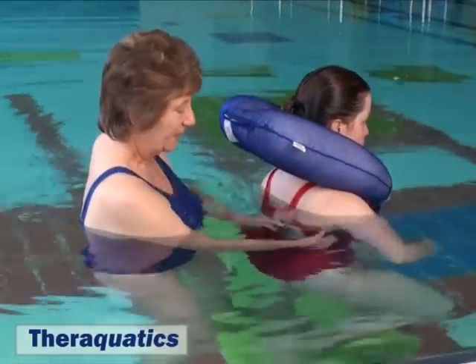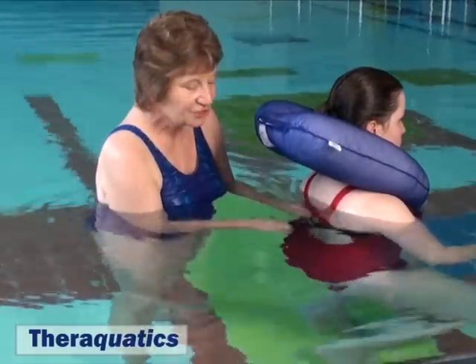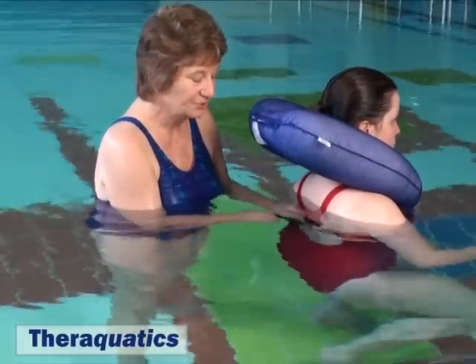Clip and fasten it behind. The strap is adjustable to bring it firm but not too tight.